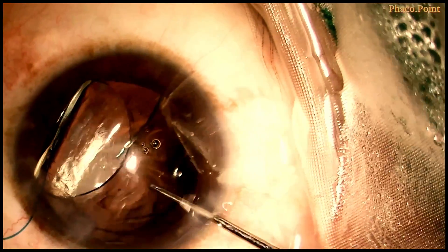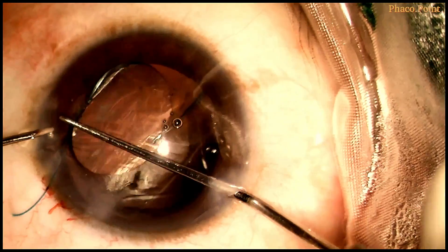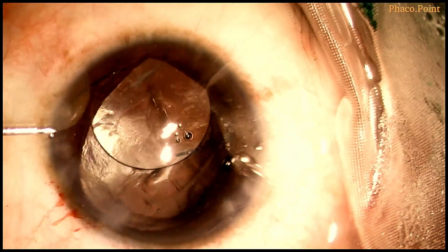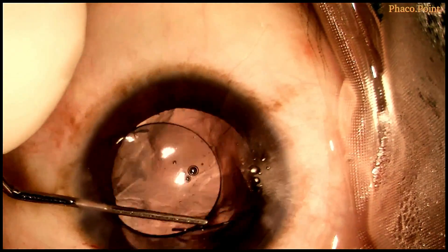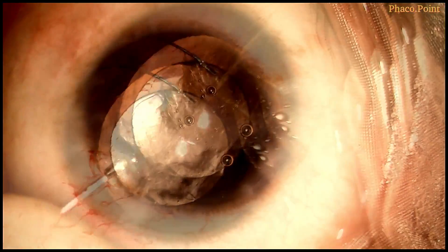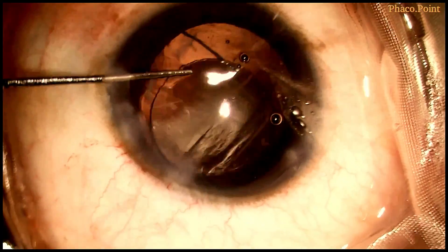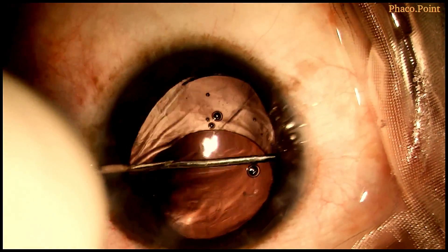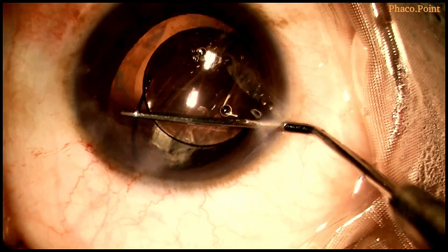The optic is rotated in the anterior chamber whilst the trailing haptic is still outside the eye. The trailing haptic is then drawn into the anterior chamber, the leading haptic is rotated and its position in the ciliary sulcus confirmed. Some more viscoelastic is injected, after which the trailing optic-haptic junction, hitched with the coagland hook, is rotated into the ciliary sulcus and the IOL is centered.